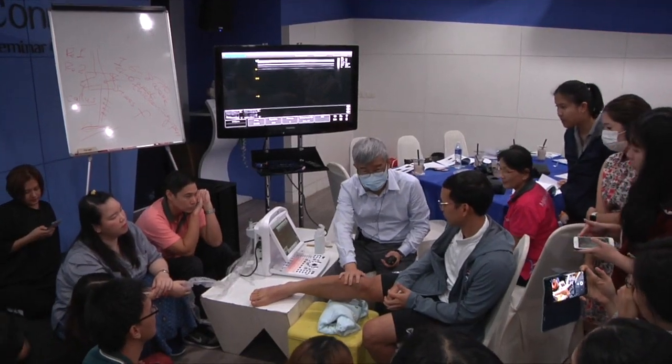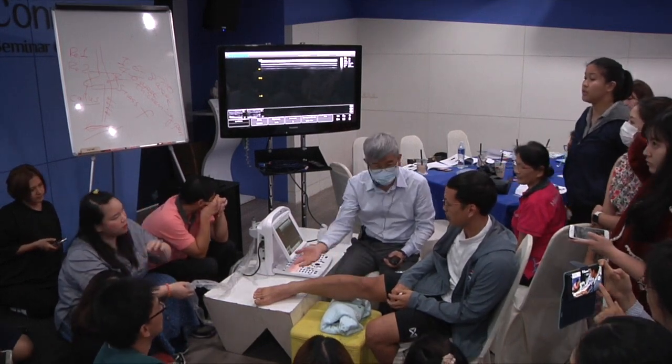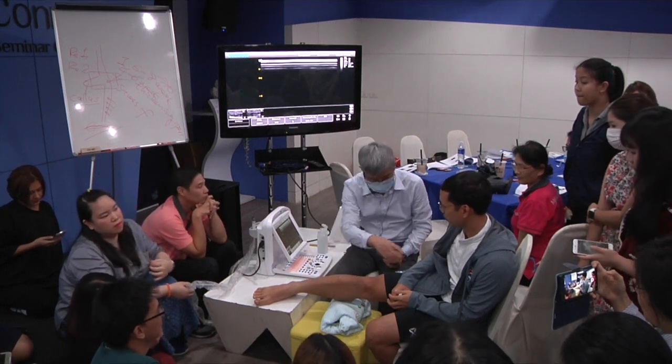Basically, we use side lying position, okay? Basically, side lying. But because we don't have a bed, so just use these, yeah.